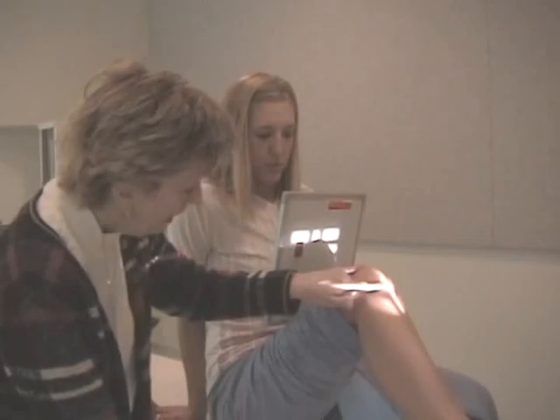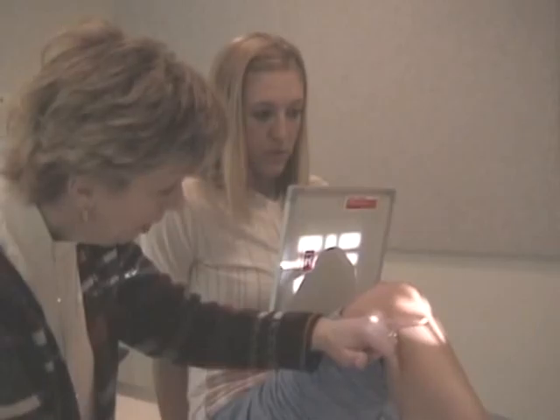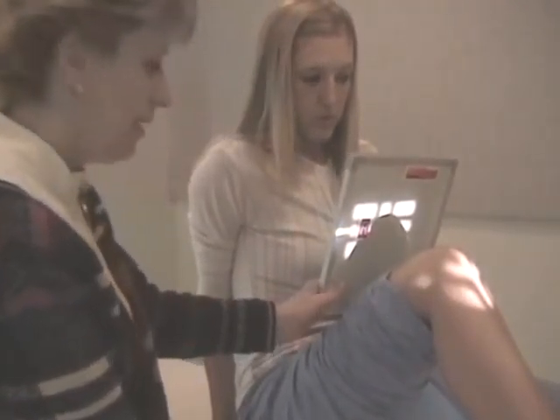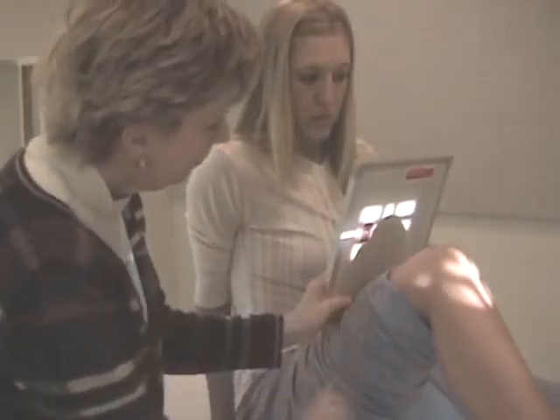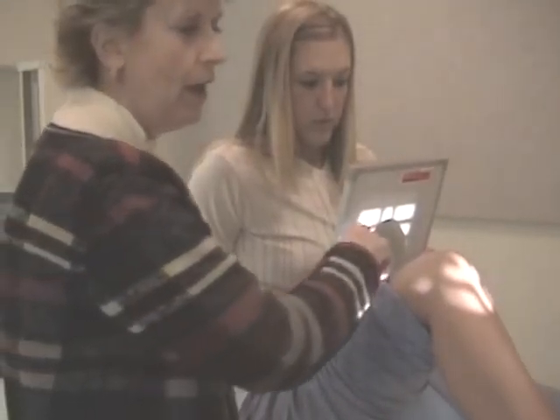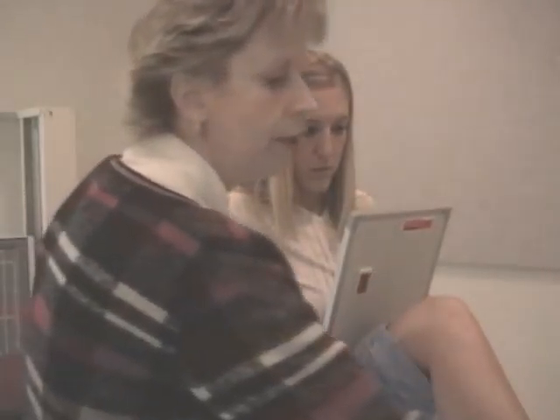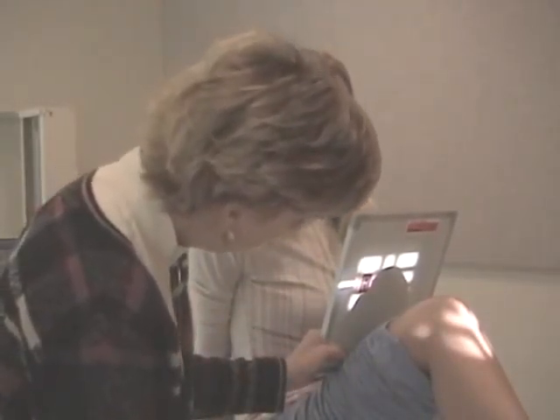Again, you analyze the angle of the patella and you adjust your tube to be at the same angle, coming through that joint space. And you make the cassette at the same angle as the tube. Okay. You have OID, and in theory, you can have an increase of SID. It's hard to show you this now, but I have about 44 inches of SID here because I'm wanting to compensate for the OID. You know, OID causes magnification, and increasing the SID can help minimize that.